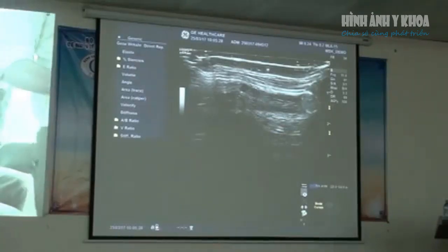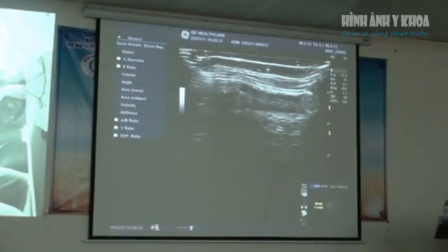So just get their hand, don't get them like that. Get them so their hand and thumb are facing all forward. And then you just push the patient's elbow back.